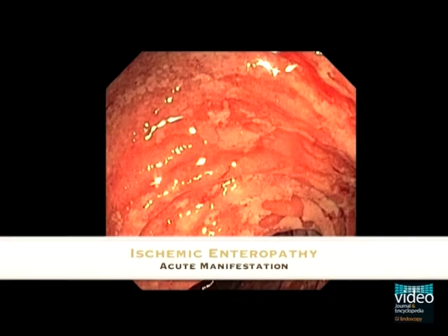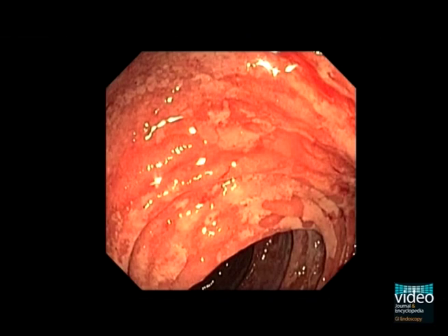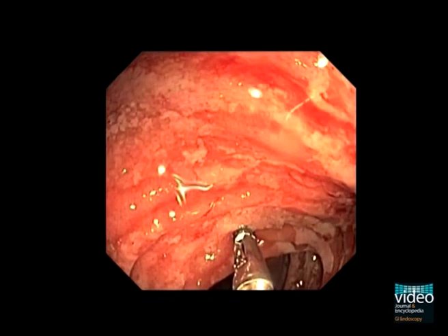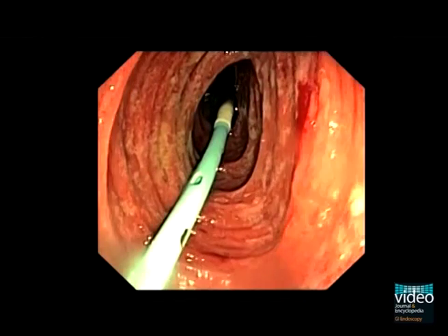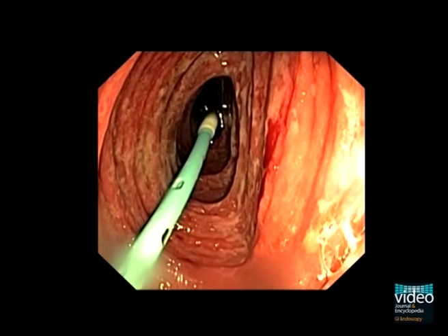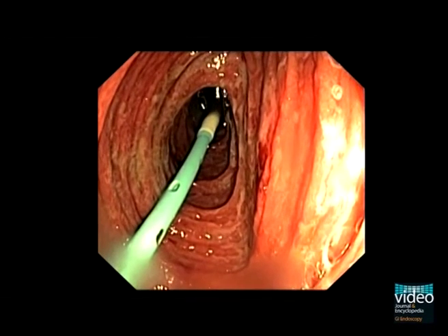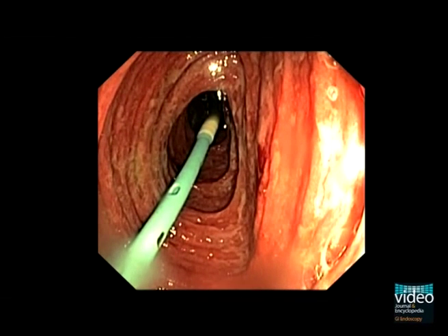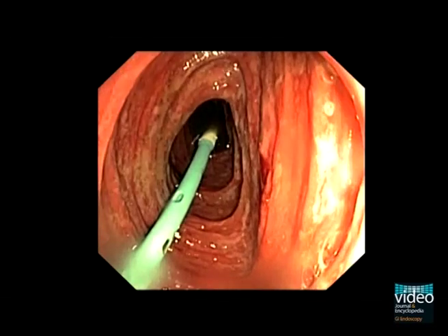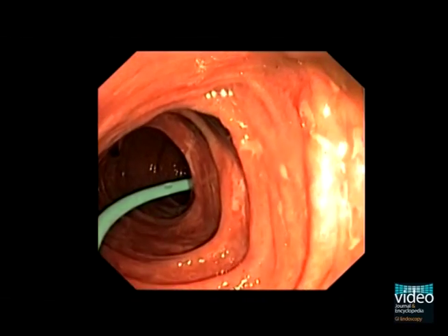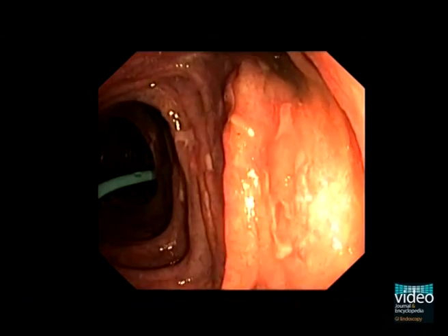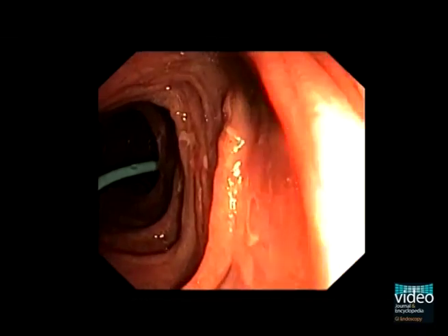Acute intestinal ischemia can be visualized endoscopically as segmental ulceration. In this case of non-occlusive ischemia in a young patient, superficial ulceration is seen in the distal duodenum and jejunum. The mucosa still looks vital as there is no bluish congestion in this segment. However, the lumen is distended and without peristalsis. Therefore, a transnasal decompression tube has been advanced endoscopically.